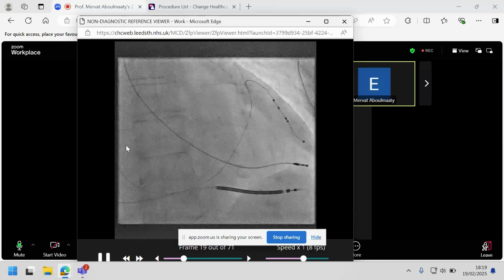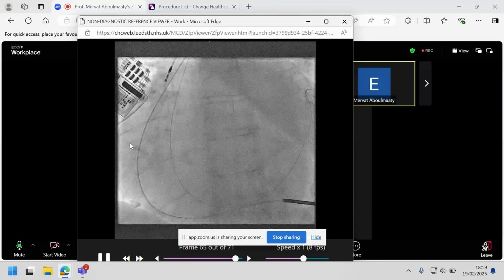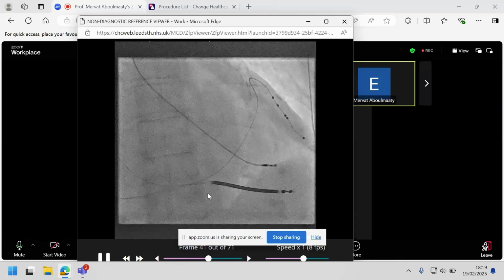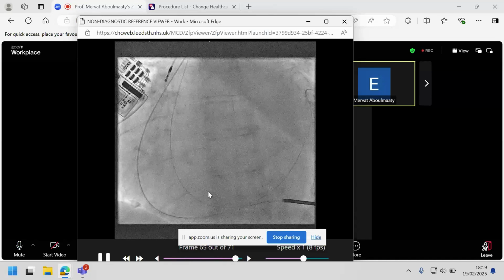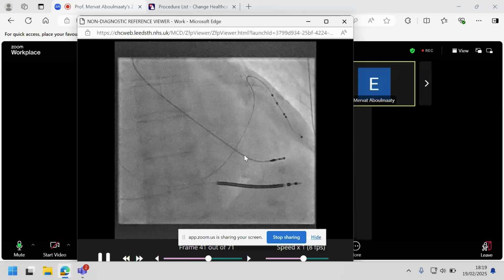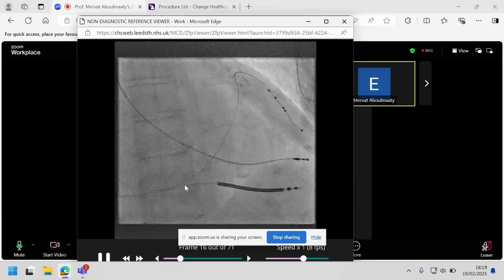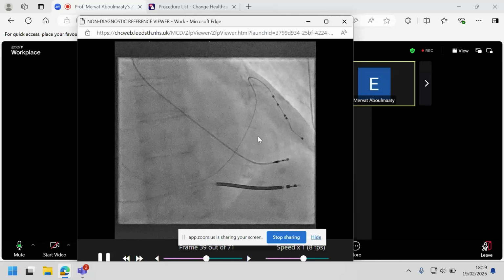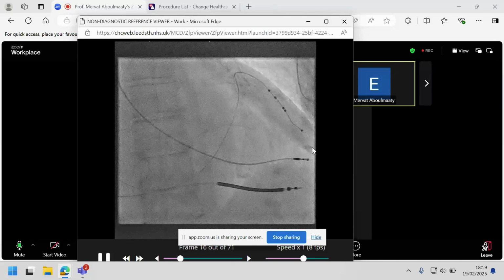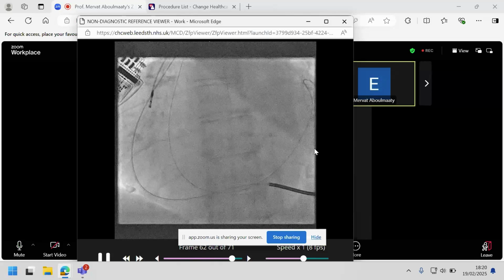block as well. So on occasion, you might encounter these patients who have very, very dilated atria. They have severe TR, and then getting a lead can be very difficult. In particular, in this case, a venogram was done, but really nothing interesting could be seen. And one of the problems of putting in a balloon catheter is that it prolapses everything out of the coronary sinus. So you've just about got in, and you put a catheter that brings it out. And I think I got lucky at this point because I just passed a wire in and hoped for the best. And sometimes without seeing, you get into position blinded.